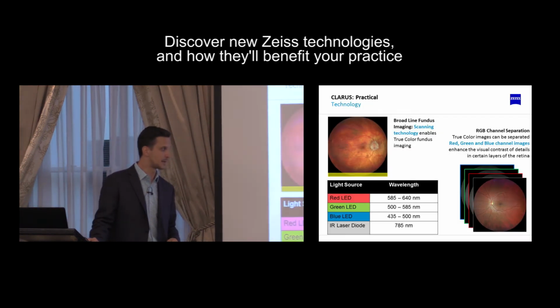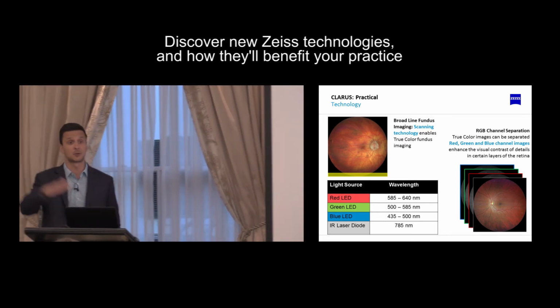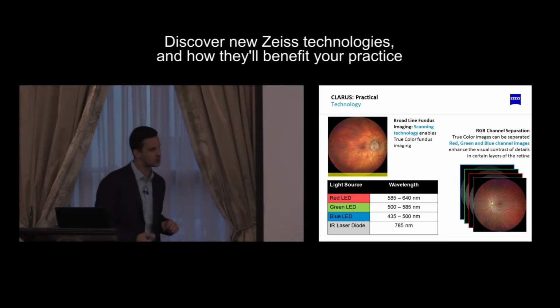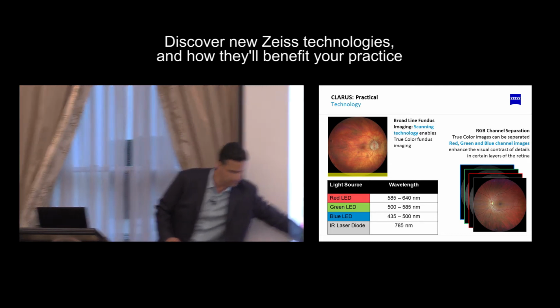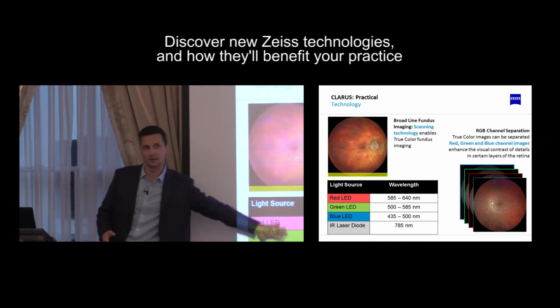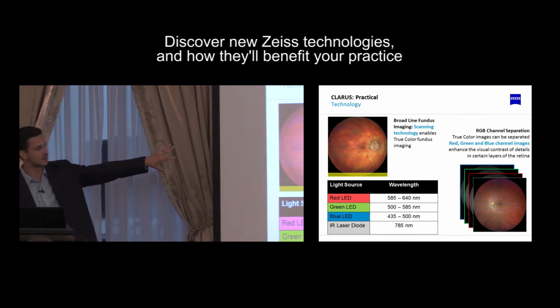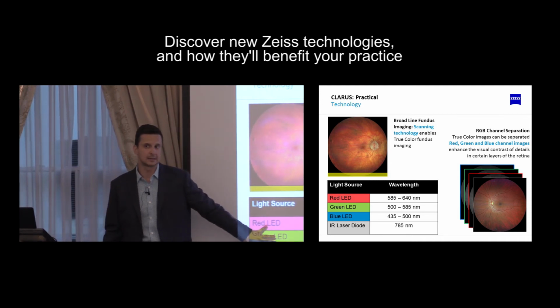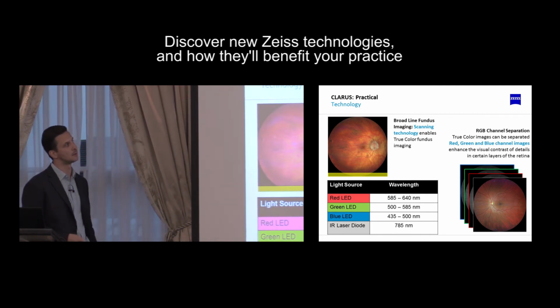The next piece about the technology that you should understand is that the technology is a spectrum. The technology is not as that image to the far left, or your right, shows, where it's got a blue, a green, and a red. It's actually the spectrum that's listed down in this piece. So sorry for the busy slide, but it really shows us what the difference is in terms of the scan. Without this spectrum, you don't actually get the true color. That's what gives you true color, because it's taking the entire spectrum and combining that as the algorithm works.